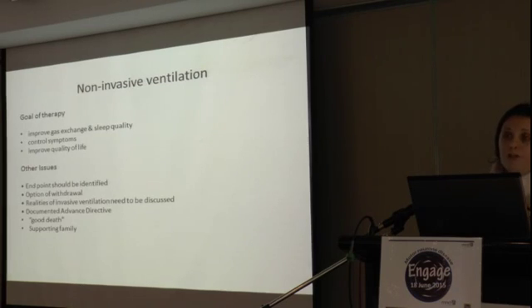And a huge part of patients coming and having non-invasive ventilation or any therapies that we've heard today is involving their carers. Because sometimes you need to be mindful the person might have cognitive impairment. Is non-invasive ventilation the best thing for that person? Would they want it? And also if they've got hand function difficulties, you need to make sure that the carer is quite comfortable with the notion of putting a mask on their face, managing it. You need to think about things such as the patient being in bed at night time. If the carer is sleeping in a different room, how are they going to manage it, how will they take the mask off? And managing all those social situations and interactions is very important to consider as well.